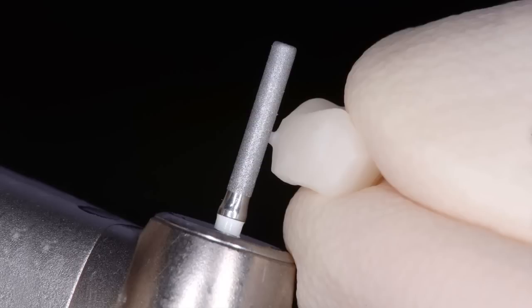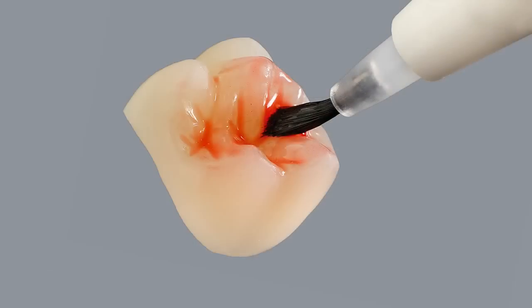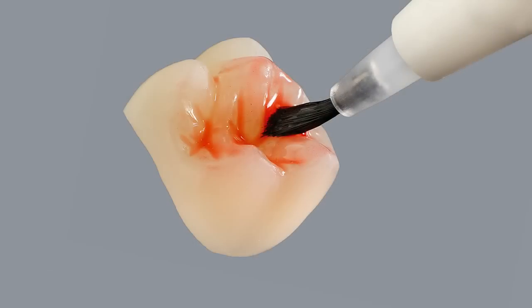The surfaces should be conditioned in the following way. There are two options. The first option is to acid etch the surface by using a 5% hydrofluoric acid gel, such as Vita Ceramics Etch. Use a disposable brush to apply the Vita Ceramics Etch to the entire surface. Etching time is approximately 60 seconds.